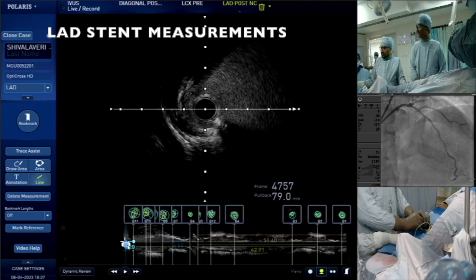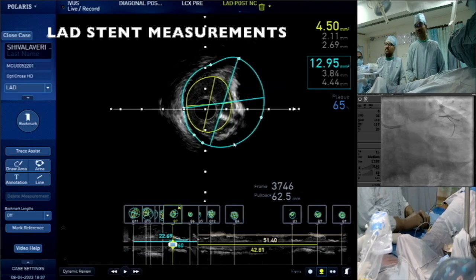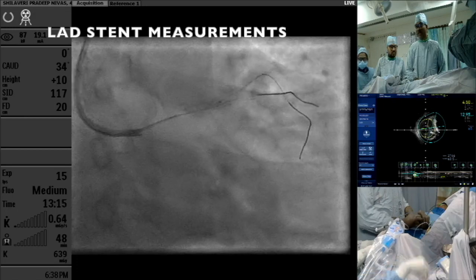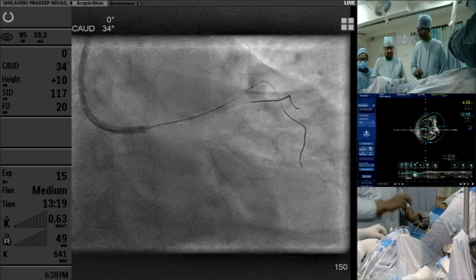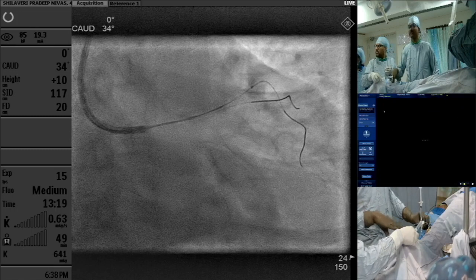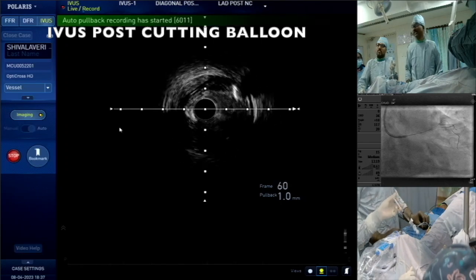What is the size? The mother. Yeah, what is the EEM size at ostial LAD? Sir, EEM we can take 3.5 easily. Okay. Yeah, so it's around 4, right? So we can take 3.5 easily. Yeah, record. Live, please. I'm live. I'm only doing the calcium area. Please keep injecting. Keep injecting.